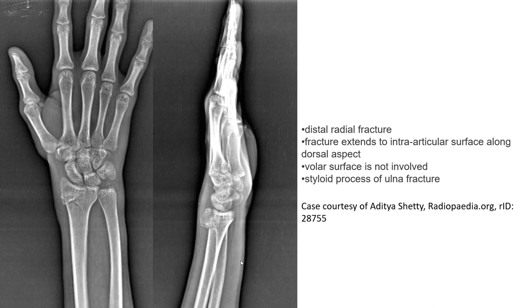This is an example of a Barton fracture where we can find a distal radius fracture extending to the intra-articular surface along the dorsal aspects, while the volar surface is not involved. Note also the styloid process fracture.